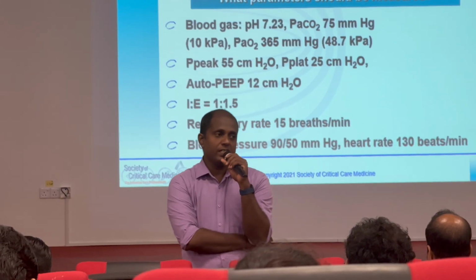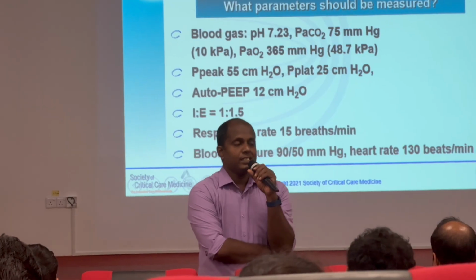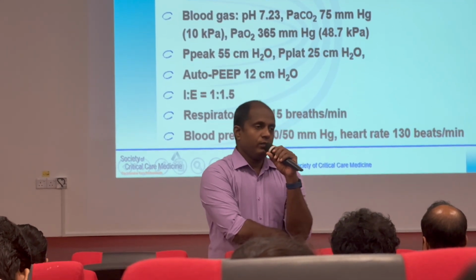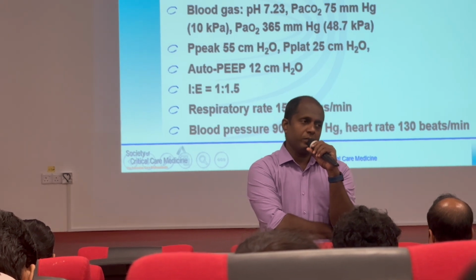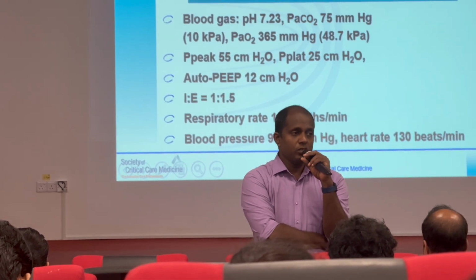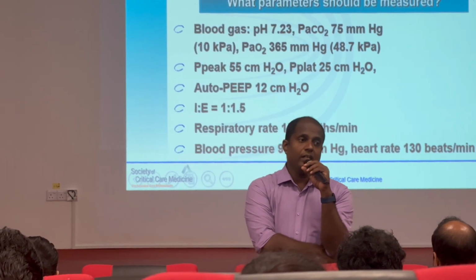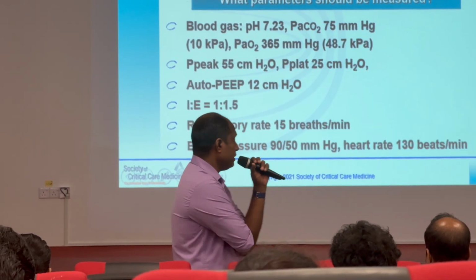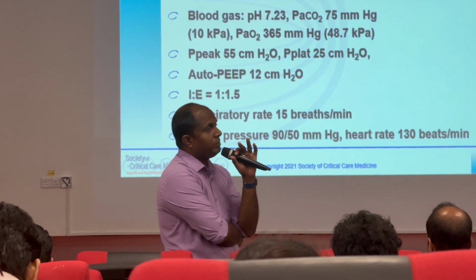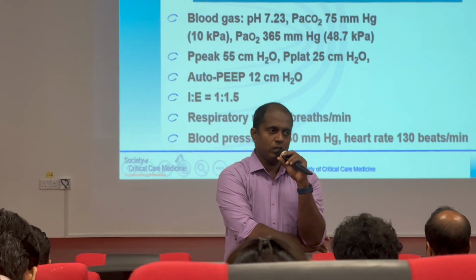So asthma ventilation, again started on low tidal volume. Always, if you are giving low tidal volume, then you are not generating more airway pressure. So airway pressure is within your control. Second thing is, it will give less inspiratory time, more time for expiration. Third one is, your peak pressures and the plateau pressures are within your control.